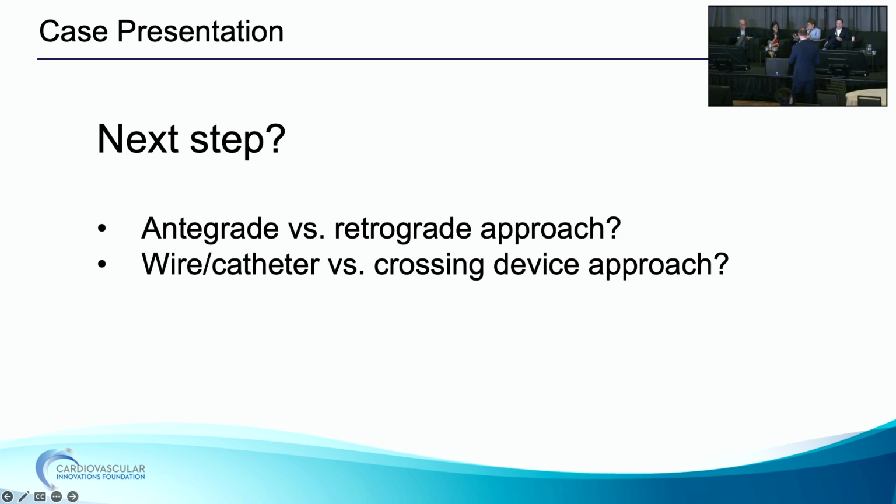Yeah, I would try from above also. I would, similar to Dr. Metzger, prep the foot at the beginning of the case, because it is very painful to prep the foot mid-case. So I would just prep it at the beginning of the case, try from above, stick with the 014 system, not because I think it's going to be true lumen, because I'm convinced it's not, but only because it will make a smaller false lumen channel. So when you're trying to get back in, maybe it might be a little less problematic.